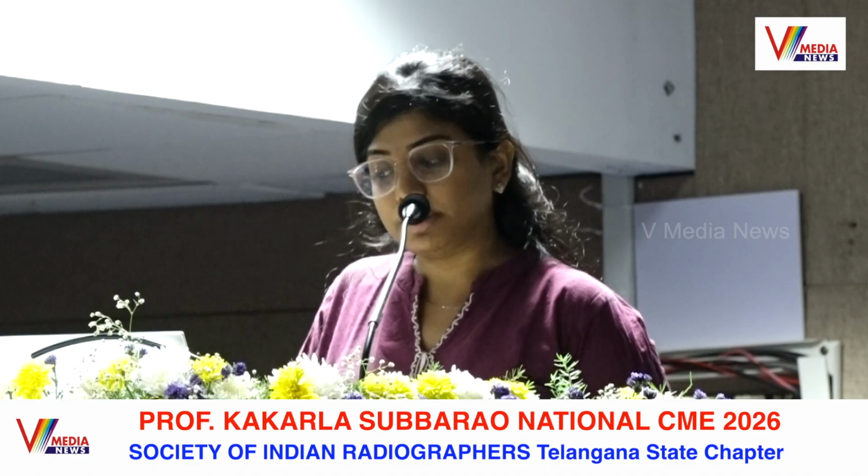There are a few pre-test instructions: no food for 3 to 4 hours prior to the exam, but you may drink water or clear fluids until the time of the exam; no caffeine products for 12 hours prior to the exam; take all regular medications the day of the exam, especially blood pressure medicine; take pre-medication for contrast allergy if present. It is reasonable to suspend metformin for at least 48 hours. We should take informed consent.